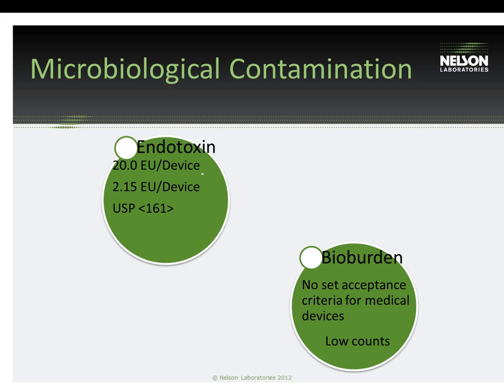To also examine microbiological contamination left behind, we recommend including endotoxin or bioburden data as part of the validation, again to help justify those overall residue values. With this endotoxin or LAL test, endotoxin being a residue of gram-negative bacteria, it has its own limits of acceptability from USP 161.